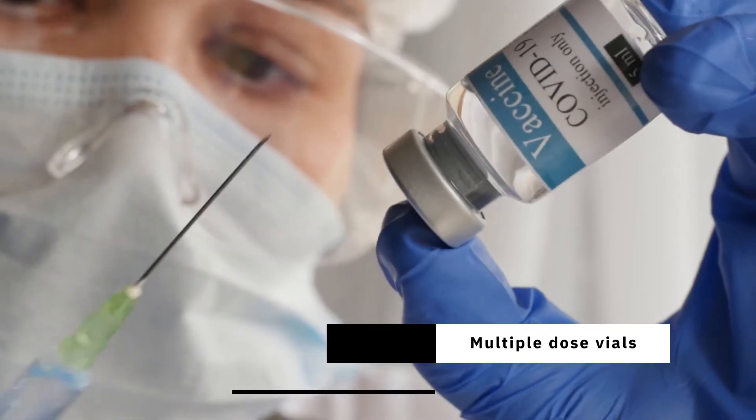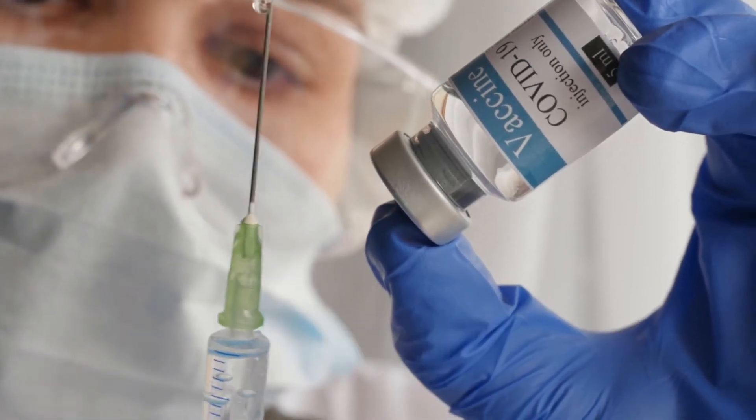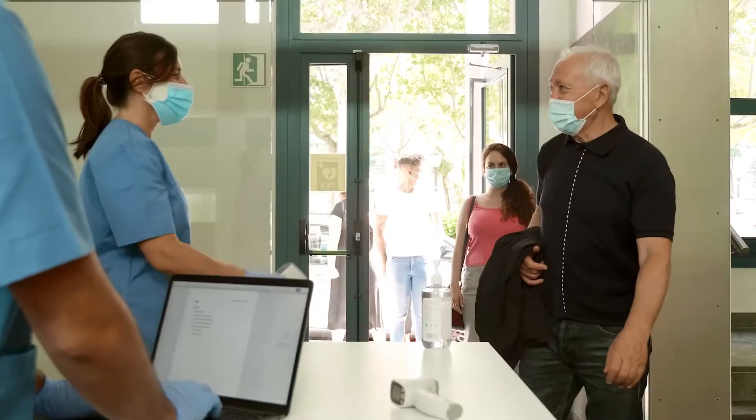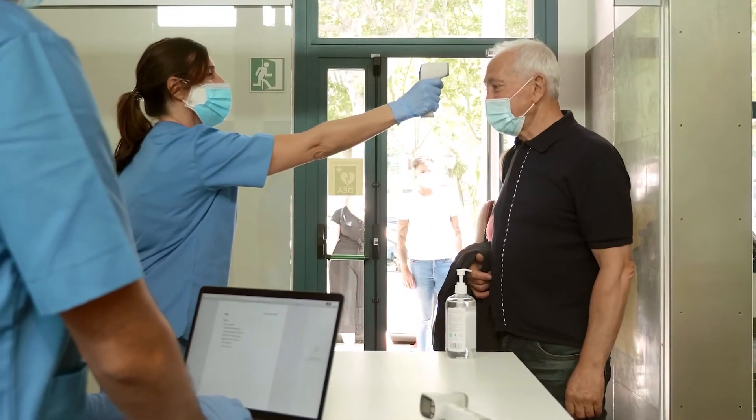So using multiple dose vials from which up to 10 syringes can be filled has now become the established method to administer the vaccine, at least during this first wave of inoculations.